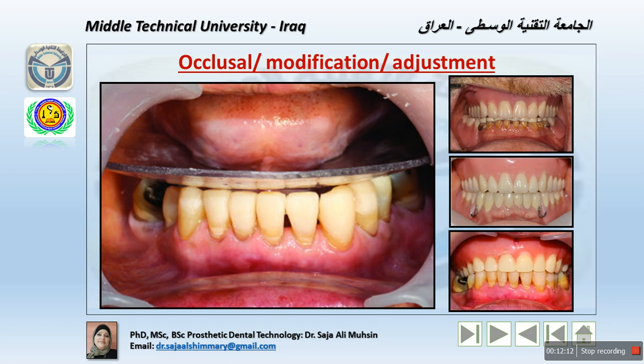After the occlusal adjustment has been made in the mouth, a new impression of the natural teeth is obtained, a new centric relation record is made, and the new lower cast is mounted on the semi-adjustable articulator. Now, the maxillary artificial teeth are then arranged for harmonized occlusion in centric relation and in protrusive movement.